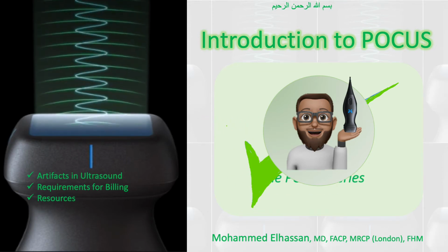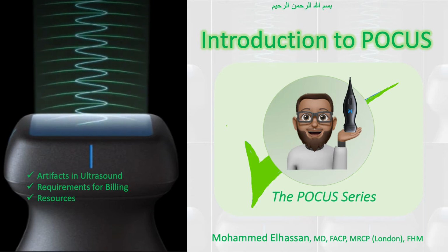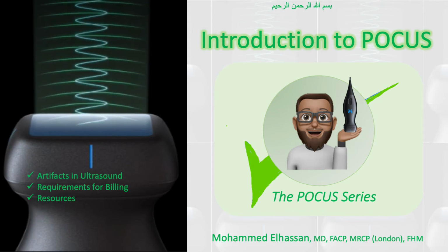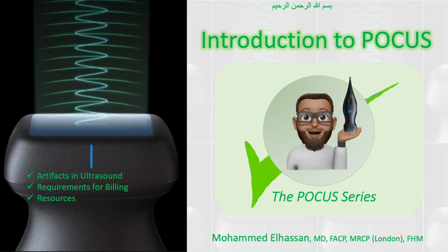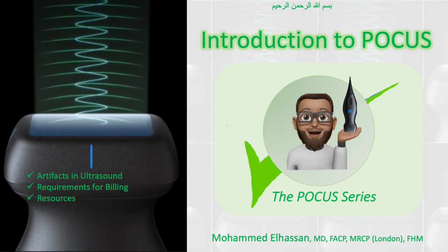We're gonna touch on the artifacts that can be useful in ultrasound. One slide about the requirement for billing, and one slide about some of the resources that you can use when you start learning about the point of care ultrasound. So let's start.